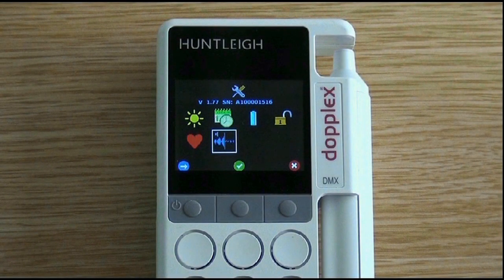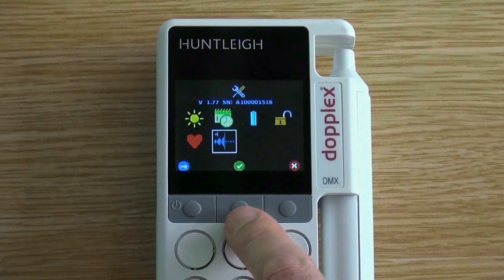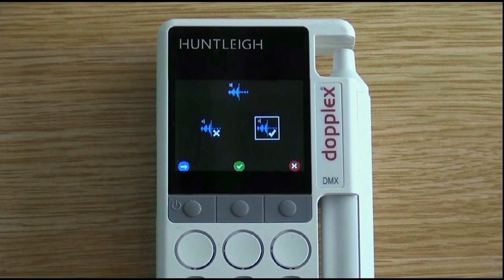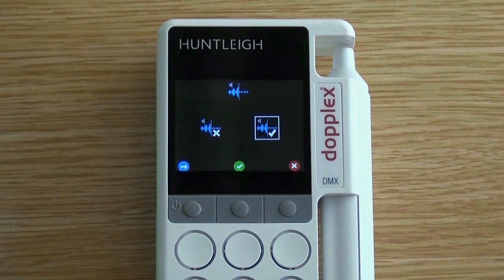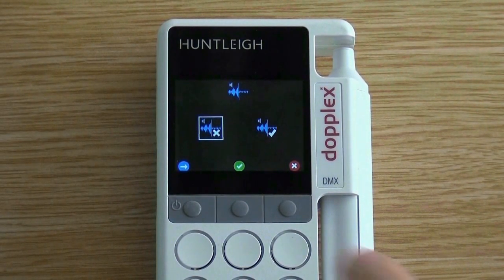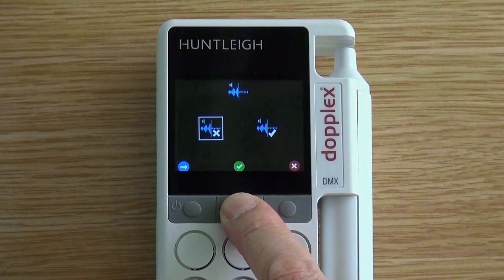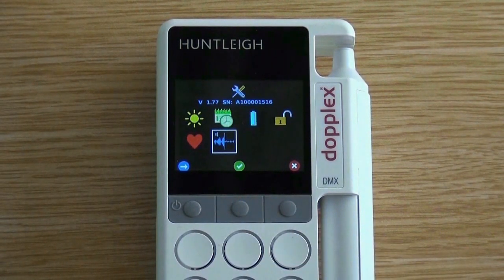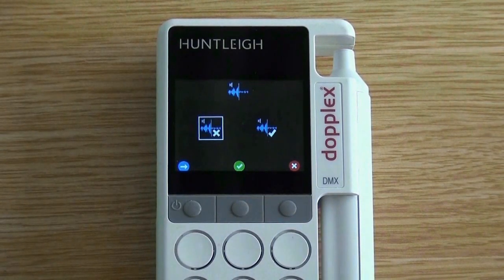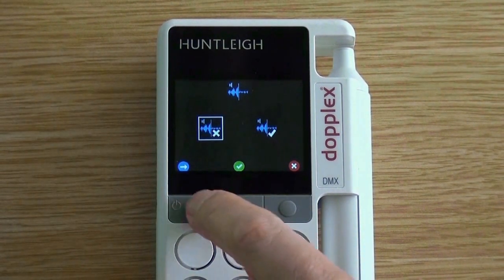Enter the setup screen by pressing the right button for three seconds. Press the left button until the noise symbol is highlighted, then press the middle button to select. This can be disabled by selecting the symbol with the cross and pressing the green tick to accept. If you wish to re-enable, move across to the symbol with a tick and press the middle button to accept.